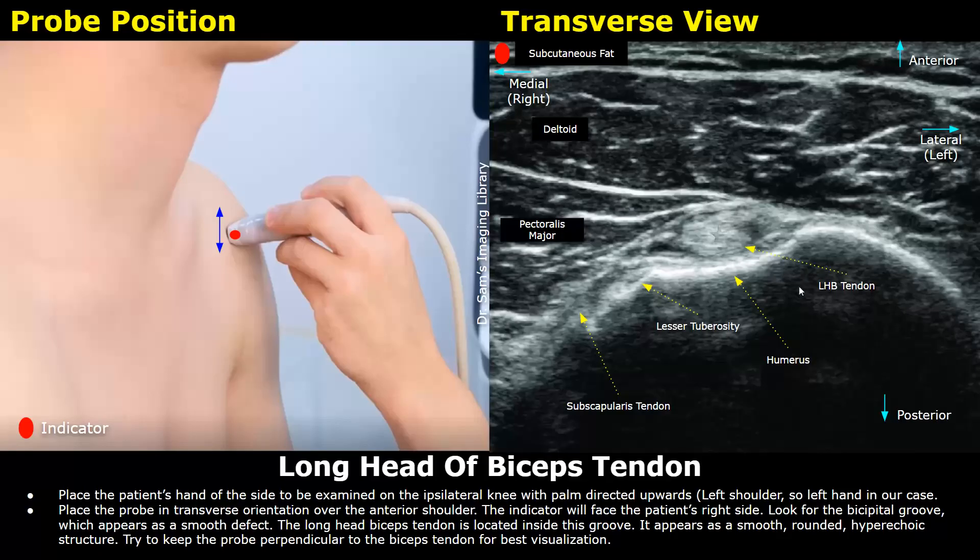The posterior part of the image is at the bottom, where the humerus is seen posterior to all structures, followed by acoustic shadowing due to the high density of the bone. Medial to the biceps tendon, this slanting hyperechoic bone is the lesser tuberosity, and you can also see part of the subscapularis tendon — it is not in full focus but still visible. The pectoralis major muscle is also present in this image, corresponding to this area in the probe position image.